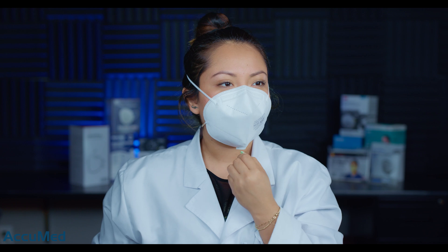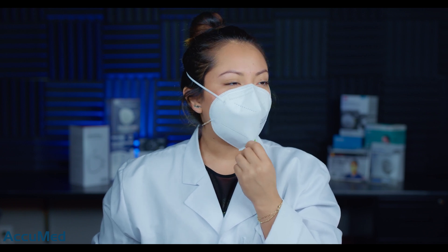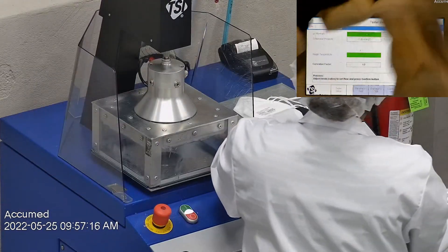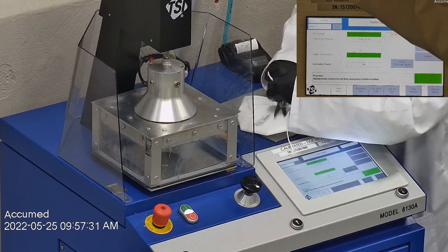In terms of breathability, I am having some difficulty breathing with these, so they might not be the most breathable, but we're going to see how they test on our TSI machine. We're going to be testing both the filtration efficiency and the breathability. This is our TSI machine model 8130A, which is also the same filtration testing machine that NIOSH uses to approve N95 respirators.